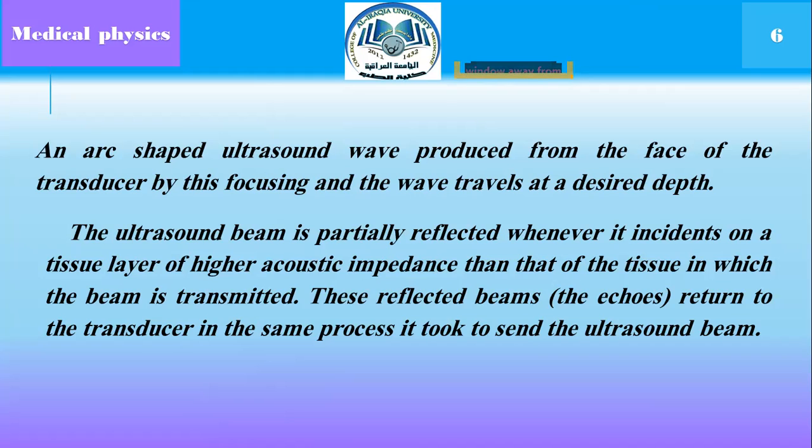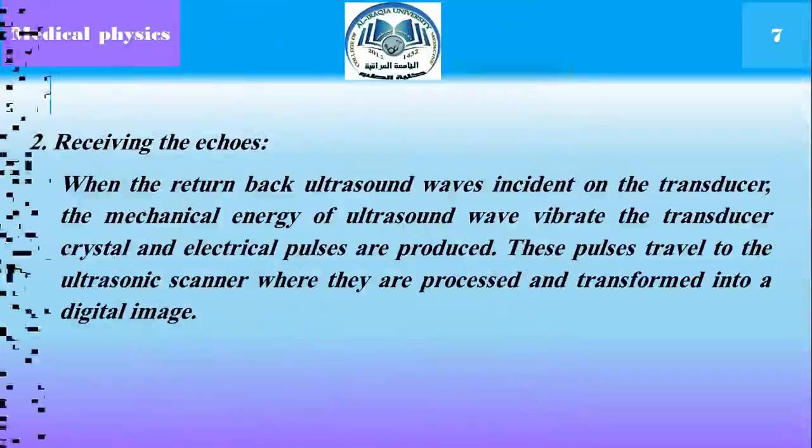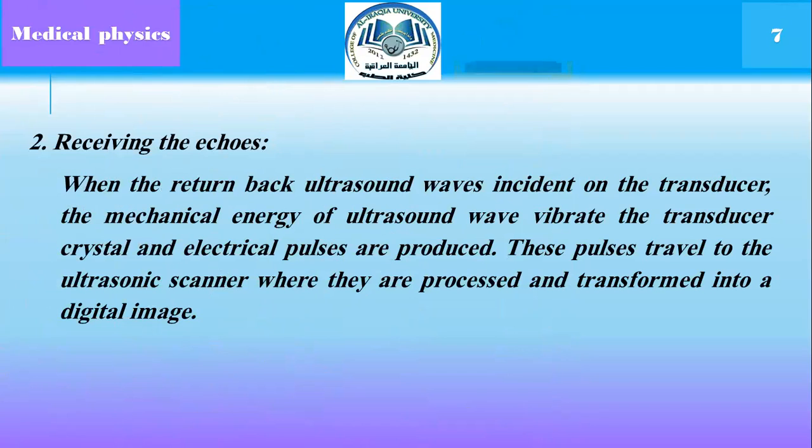2. Receiving the echoes. When the returning ultrasound waves are incident on the transducer, the mechanical energy of the ultrasound wave vibrates the transducer crystal and electrical pulses are produced. These pulses travel to the ultrasonic scanner. They are processed and transformed into a digital image.